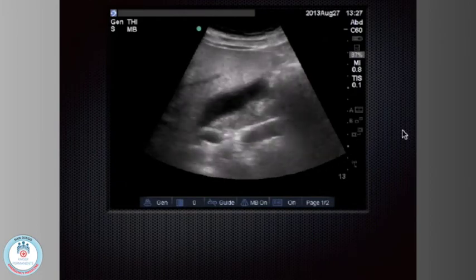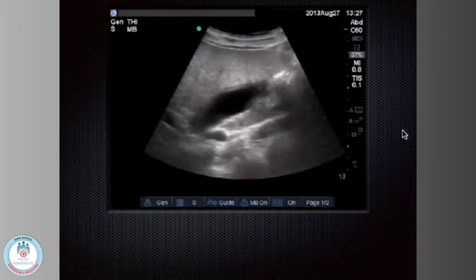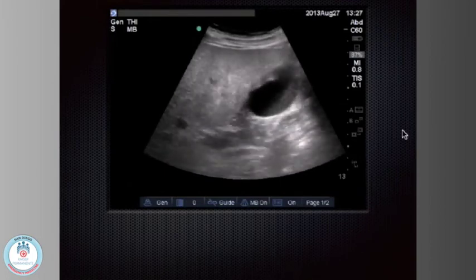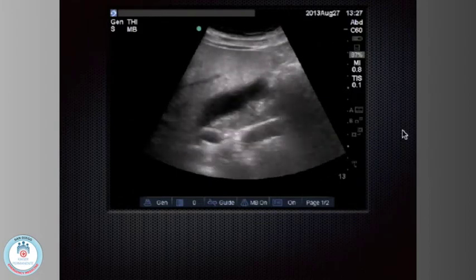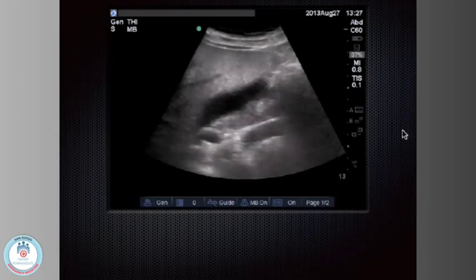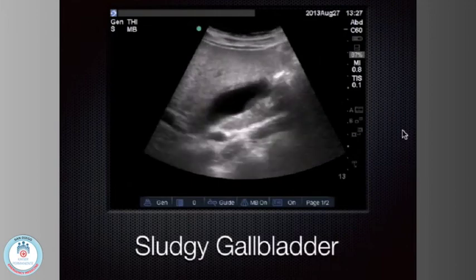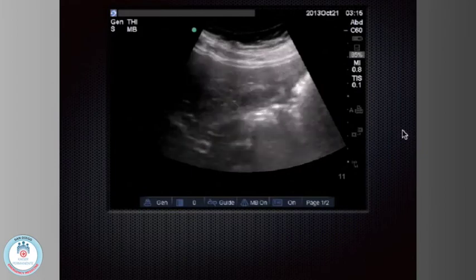Sludge. Meniscus. Sludge layers out like that, a nice clean meniscus. Because sometimes when I see sludge, I get a little nervous about cholangio. If it's irregular-based sludge, I want to call it sludge, but wait a minute. Cholangio can kind of look like that because it's less echogenic. It's hypoechoic, and it looks like sludge sometimes. But as long as sludge layers out nicely like that, like a nice, smooth isoechoic meniscus, then I'm happy. How about this one here?